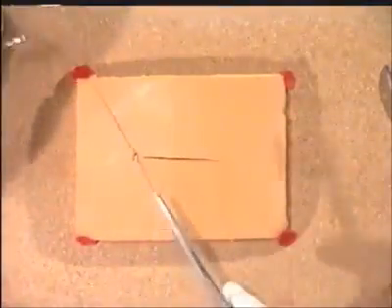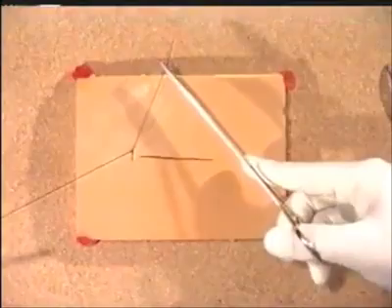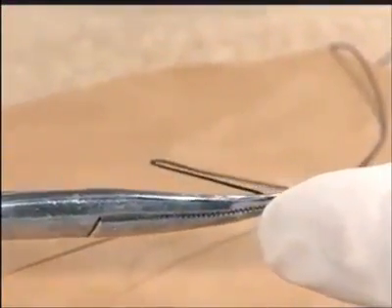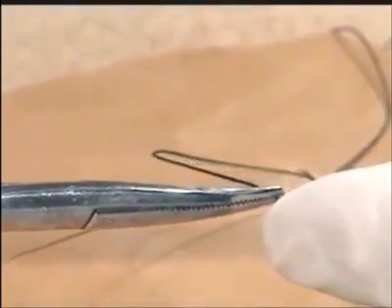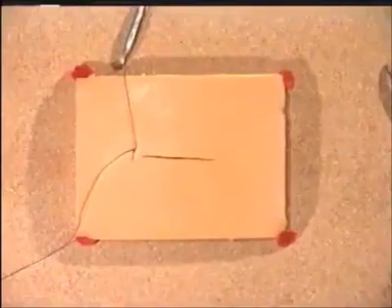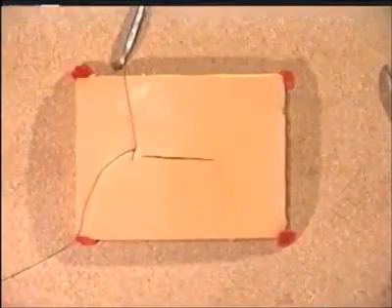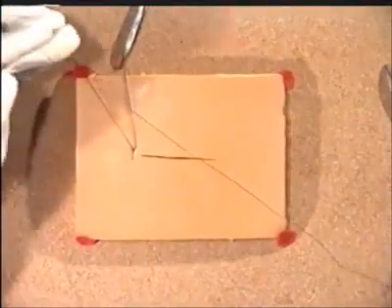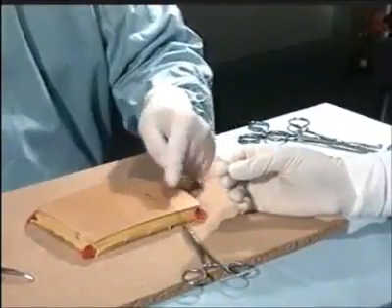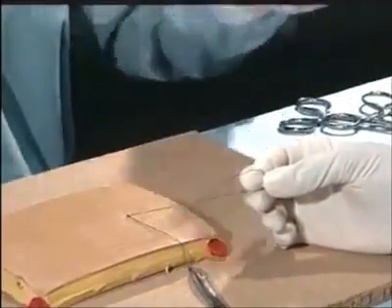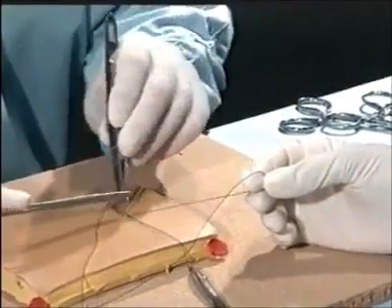In this situation, let us assume that we wish to maintain a hold of the end of the short suture as a stay. In this case, get your assistant to place a hemostat on the end of the suture, grasping it right at the tip of the jaws, not up near the hinge where it would slip. Grasp it in the tip of the jaws, and place to one side. Then pass the other length of the suture to your assistant, and make sure that they hold it the right distance from the wound. Not too close, and not too far away.